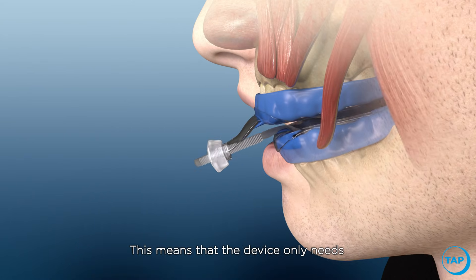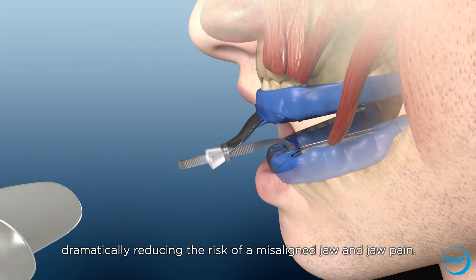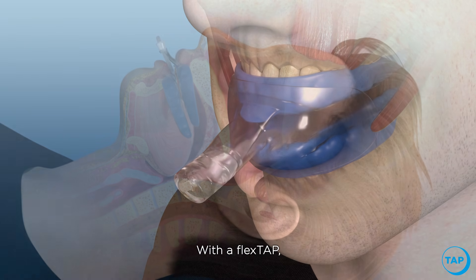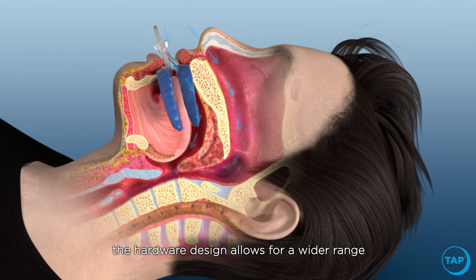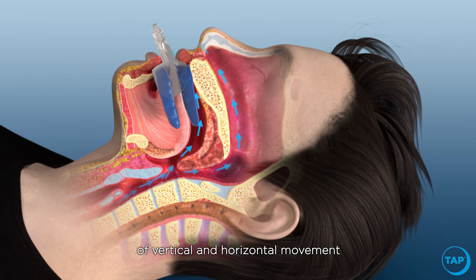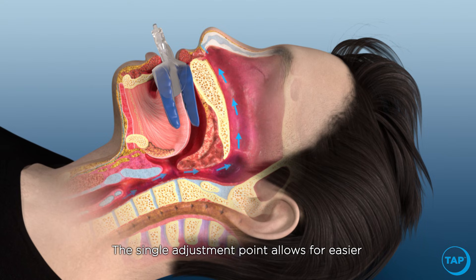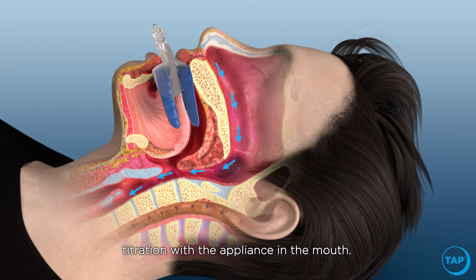Flex Tap has a single point midline advancement, meaning the device only needs to be adjusted from one point, dramatically reducing the risk of a misaligned jaw and jaw pain. The hardware design allows for a wider range of vertical and horizontal movement so that the patient can breathe easily. The single adjustment point also allows for easier titration with the appliance in the mouth.